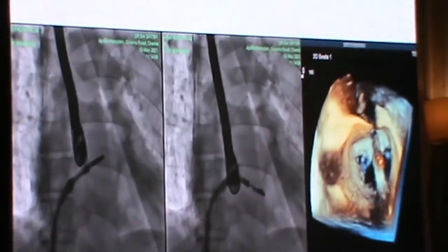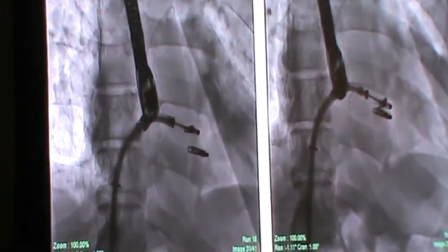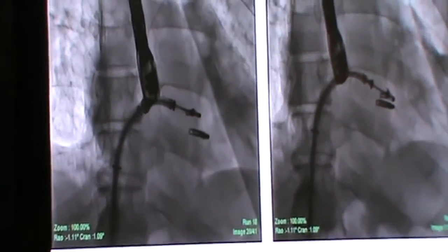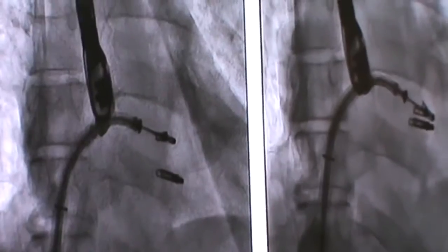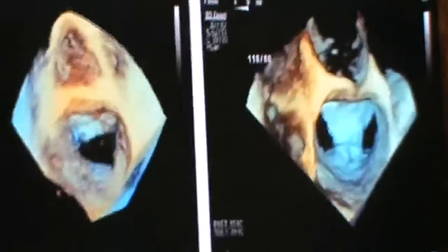So that is the 3D echo, where we looked at the heart, we went ahead, we clipped it. After one clip, we realized that the leak had got better, the patient was behaving better. Literally a crashing patient who had come in by air ambulance, suddenly the blood pressures were better. So we decided, let's do everything we can, put a second clip right next to the first. That big hole is not supposed to be there.